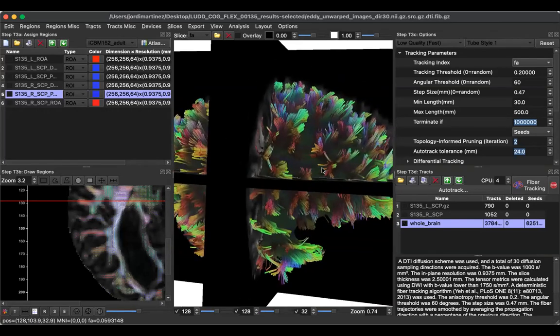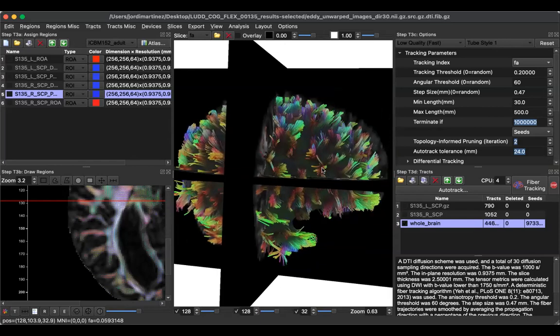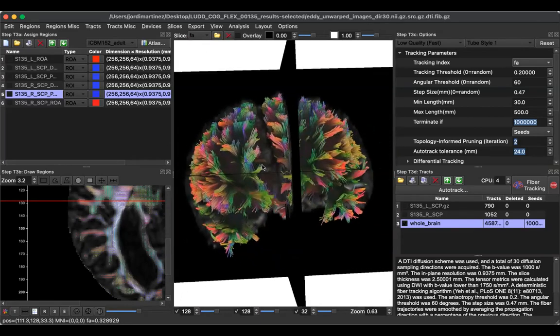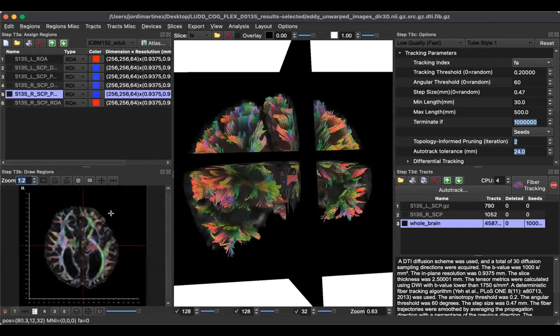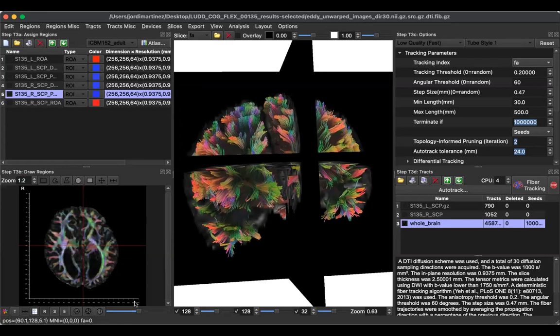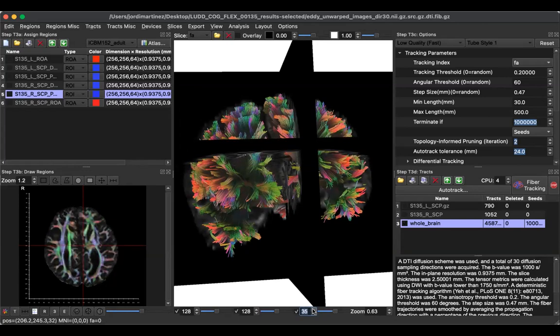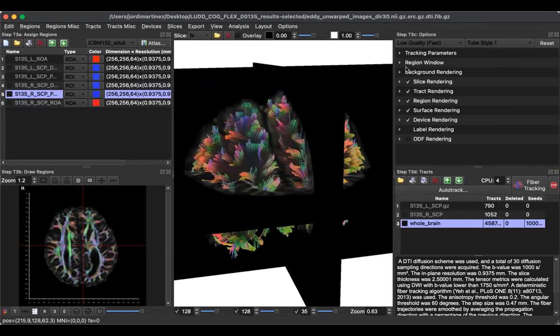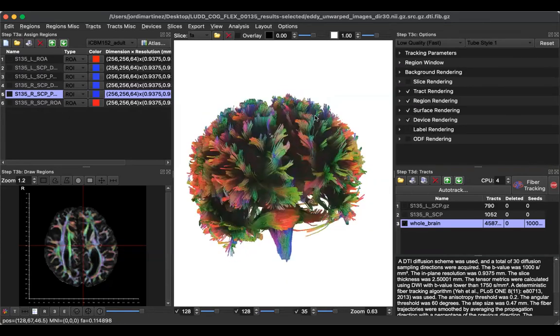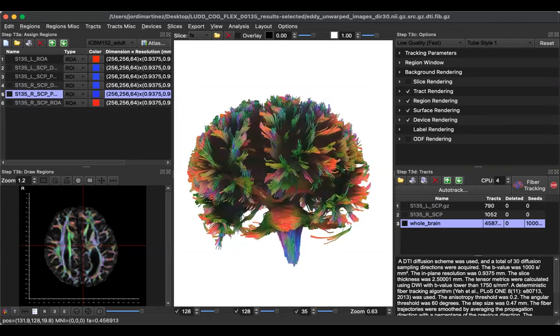Before I find other differences, sorry, my computer's really slow. Other DTI measures like MD, RD, so maybe some specific changes will be affected by that. You have all of those other measures, right, besides FA? Yeah, he has all of them, but we didn't put that in the other paper because it made it messy. Put it here. There are a whole bunch of them, and the interpretation in agenesis is different. We can check here to see what they look like. We just start cutting into it and then put it on one side.